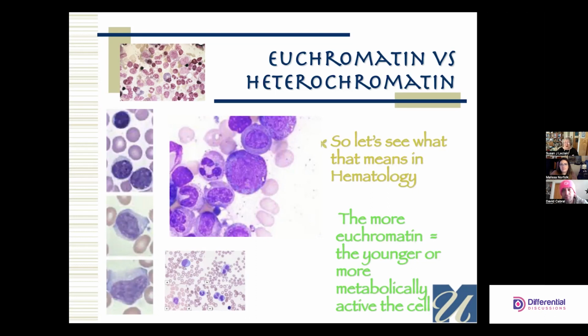So you want the most active, and I think you can see it in this one, you want the most active pieces of DNA to get as close as they can to the nucleolus so that communication between the messenger RNA and the DNA allowing for transcription occurs easily.